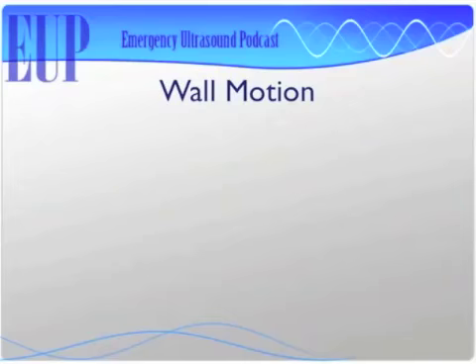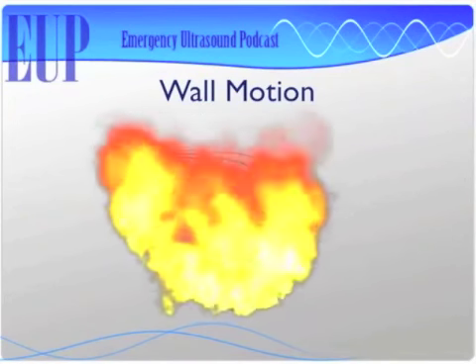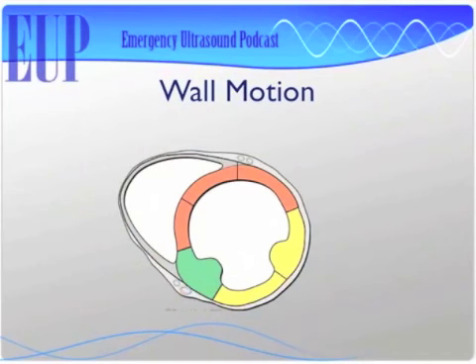All right, welcome to the Emergency Ultrasound Podcast. Mike Mallon here again with Matt Dawson. Today we're going to talk about wall motion and segmental wall motion abnormalities.